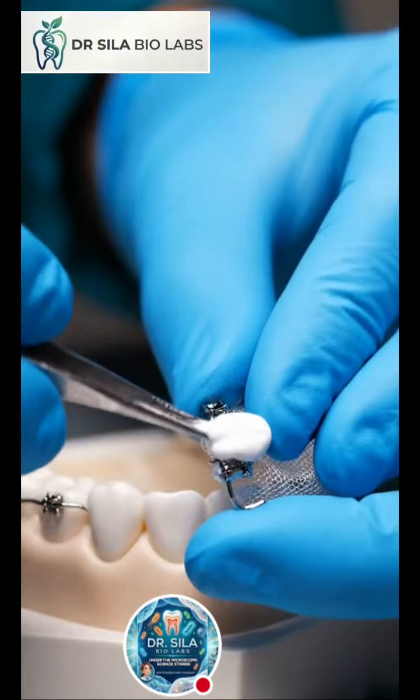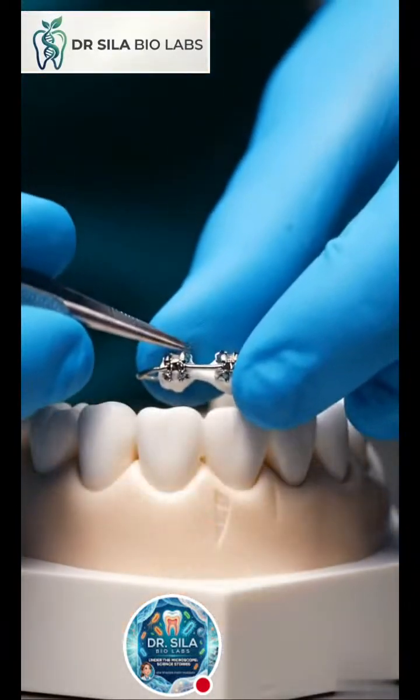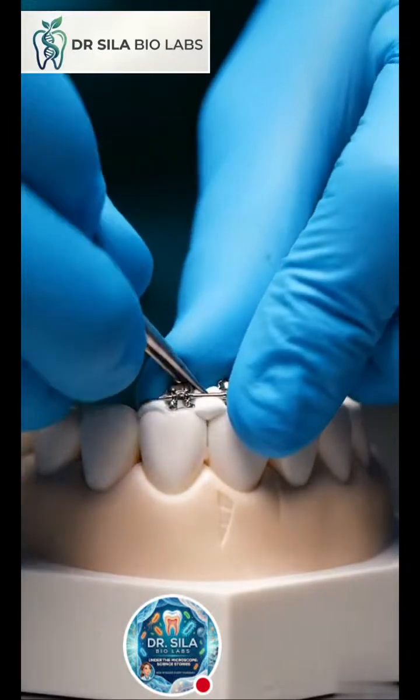The adhesive paste is smoothly applied to the bracket's fine mesh bonding surface. The bracket is then carefully aligned with the guideline.